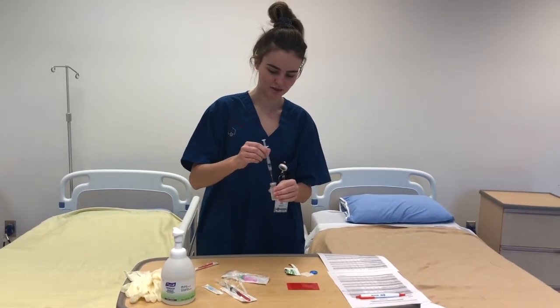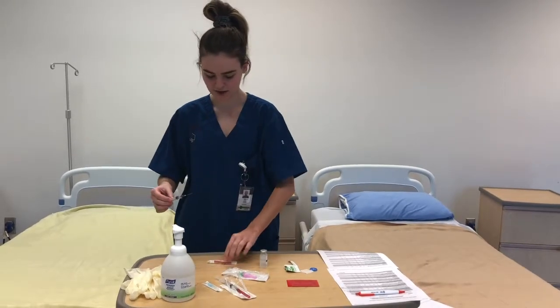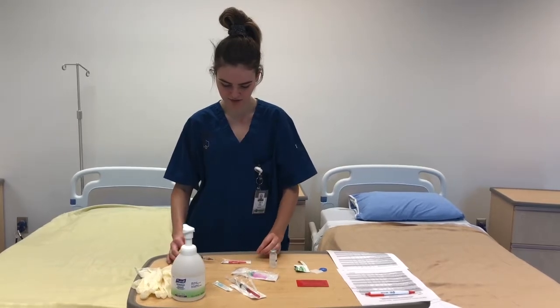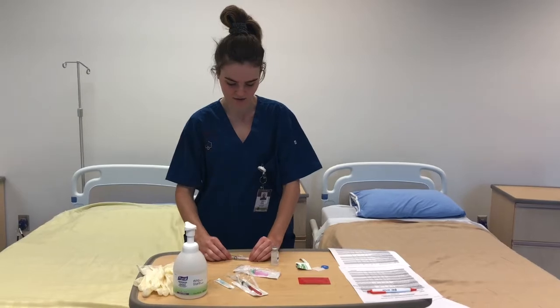So now I've got 0.5 milliliters of Haldol, and properly, without getting a needle stick injury, I'm going to insert it into the cap, and once it's inserted, I can pop it onto the lid.